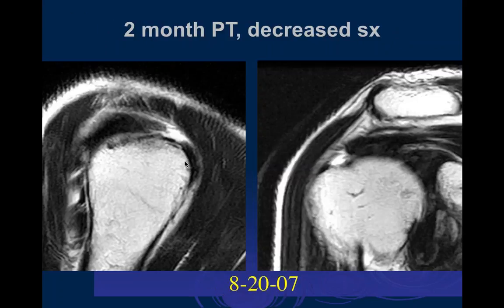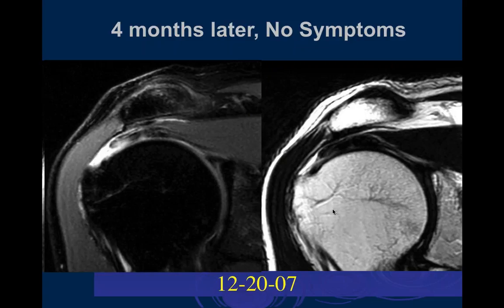Now this is 2 months later. What do you think at this point? Two months later, I'd say essentially very similar. No significant change. I still see the full thickness tear. If anything, it's a little bit better defined. At this point, the symptoms were a little bit better, but it still hurt.